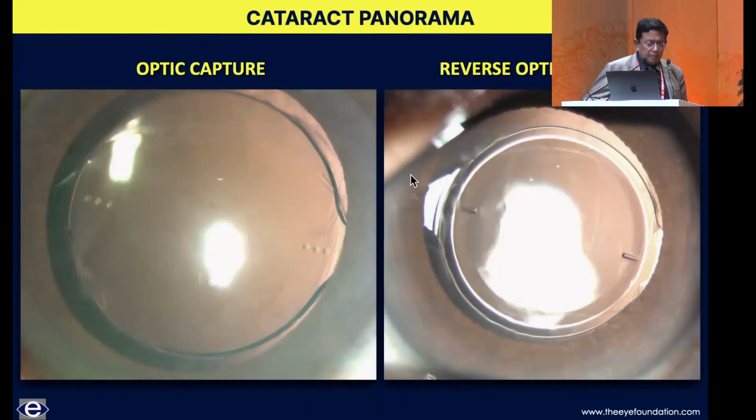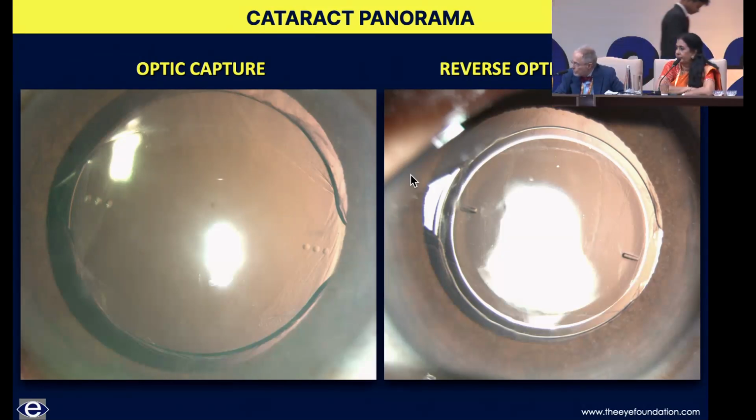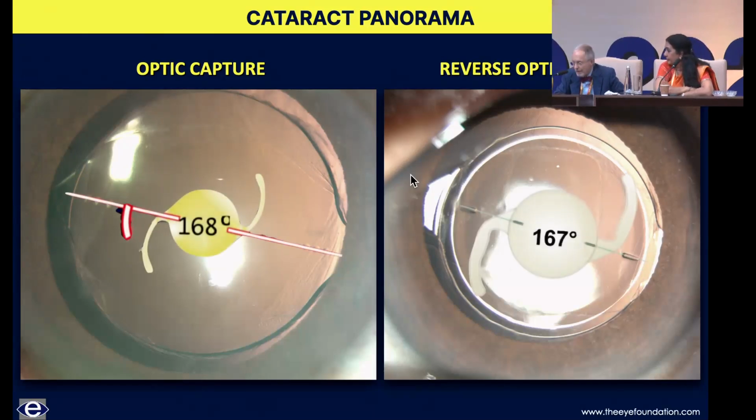visual outcome. This is not something I'm recommending, but because our toric intraocular lenses are so frequently used, are there any toric 3-piece lenses available at all in the world? No. Not that we have, except we have the advantage, as David will point out, that we could put a light adjustable lens in, and then we could do a postoperative adjustment. But of course, that happening on the table, when you haven't gotten consent from the patient, is a big problem.